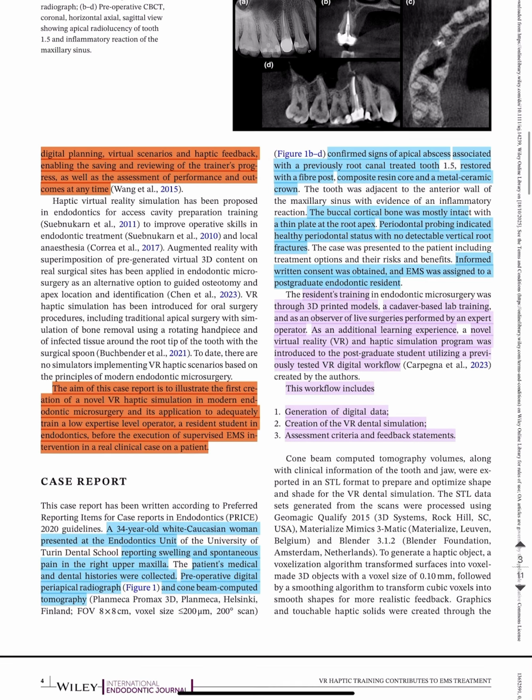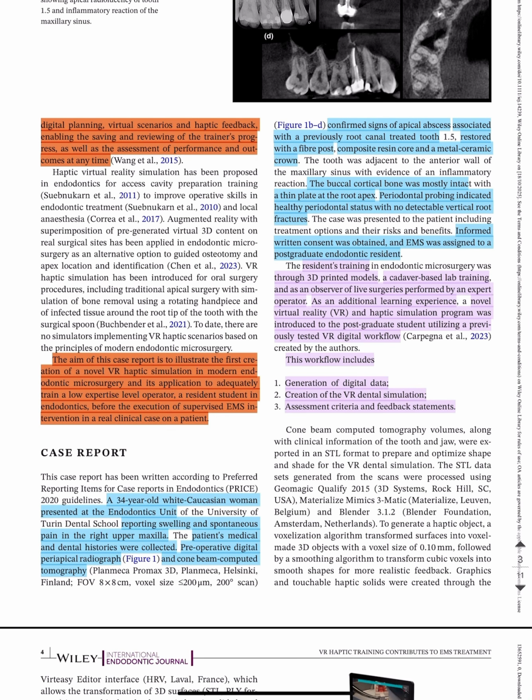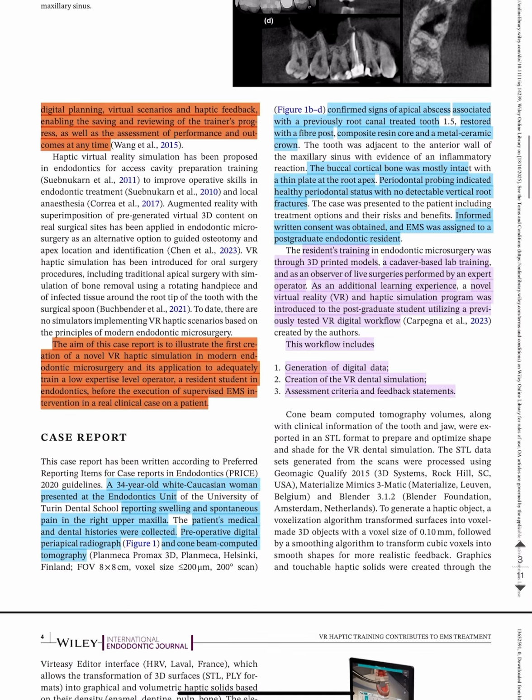The buccal cortical bone was mostly intact with a thin plate over the root apex. Periodontal probing indicated a healthy periodontal status with no detectable vertical root fracture. An informed written consent was obtained from the patient, and the endodontic microsurgery was assigned to be performed by the postgraduate endodontic resident. The resident's training in endodontic microsurgery was through a 3D printed model, cadaver-based lab training, and as an observer of live surgeries performed by an expert operator.